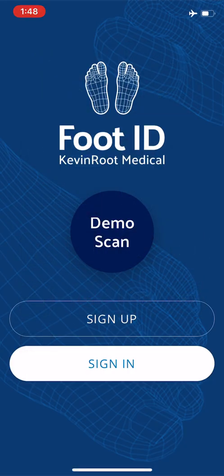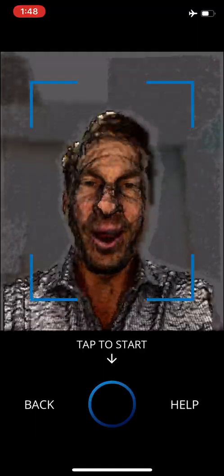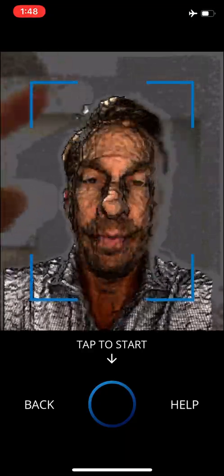Right away here, there's a demo scan. You're going to have to click OK. FootID only works with the front-facing camera on the iPhone 10 or later models. It doesn't work with the camera on the back of the phone.